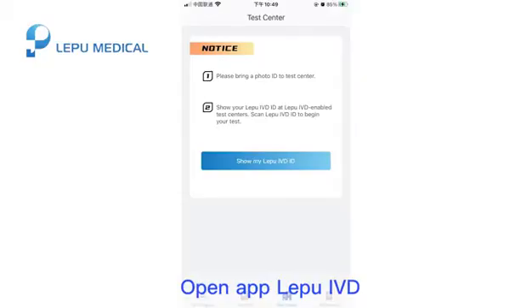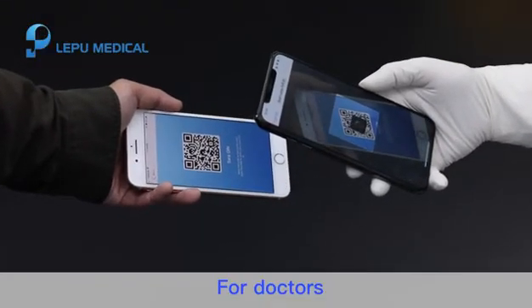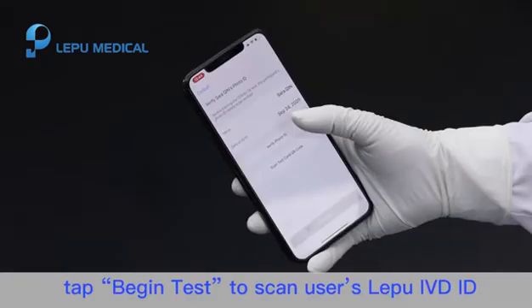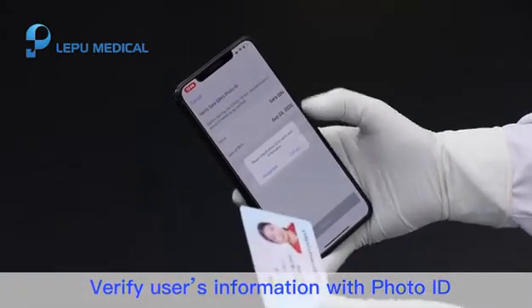Step 1. Open app Le Pu IVD and show your Le Pu IVD ID to the doctor. For doctors, log in to Le Pu IVD doctor and tap Begin Test to scan the user's Le Pu IVD ID. Verify the user's information with photo ID.